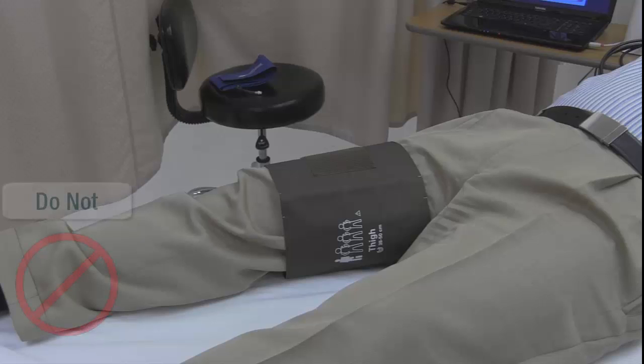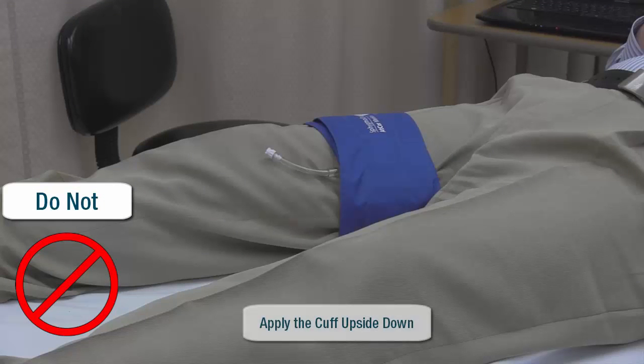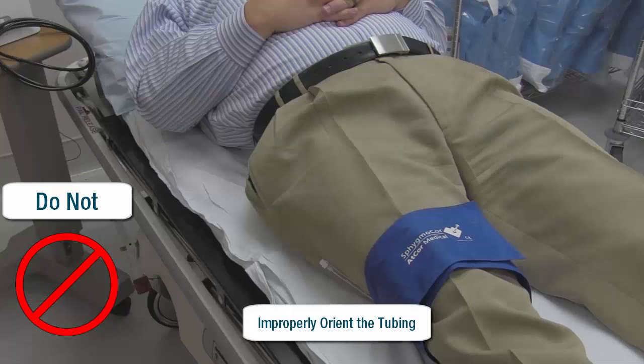Take caution to not use any cuff other than the light blue thigh cuff. Do not place the cuff upside down. Do not orient the cuff so that the tubing is anywhere other than the top of the thigh.